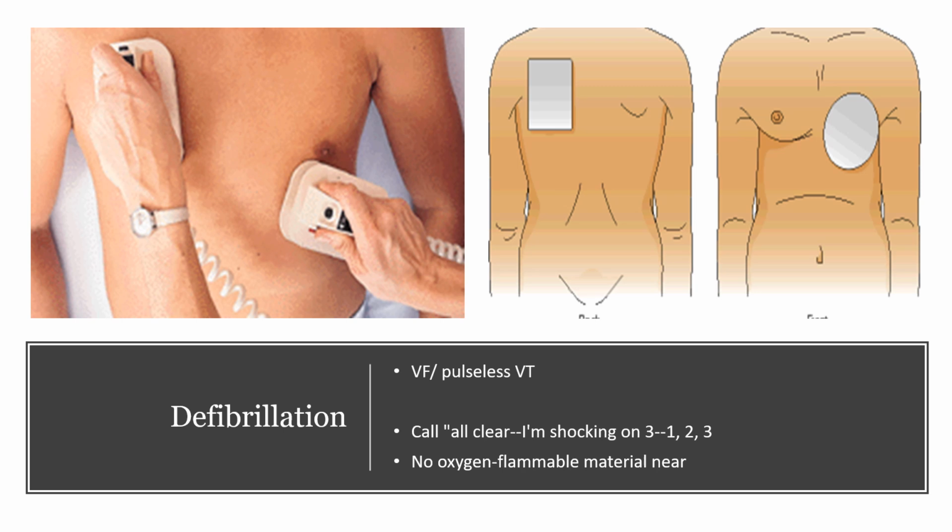When we are attaching a defibrillator, again, looking at the patches, there will be instructions on the patches, 2 different ways to put on these. If possible, we can put them both on the front of our patient, or we put one on the front and one on the back. Again, if you look at the pads, it tells you exactly where they go. We want to make sure there's a good stick to the patient's chest. So if you have a really hairy patient, yell for someone to bring a razor and you might have to shave a small area to stick that patch on.